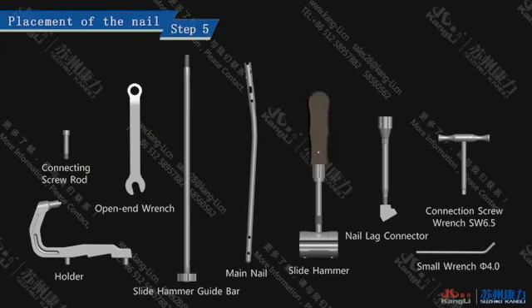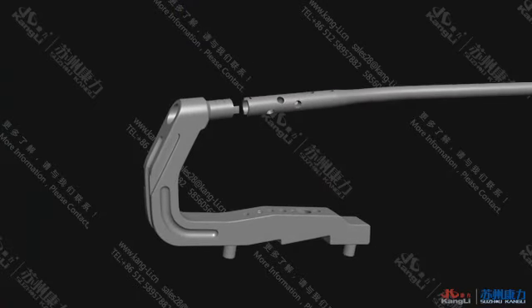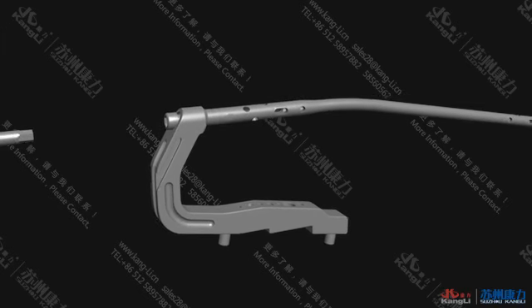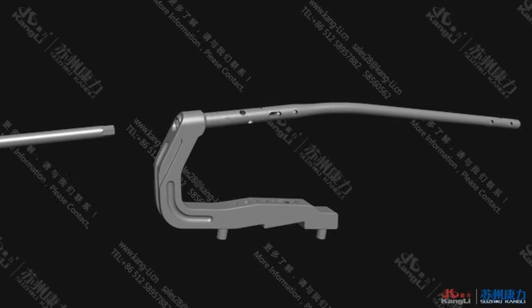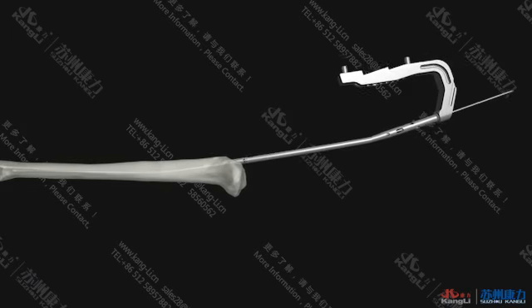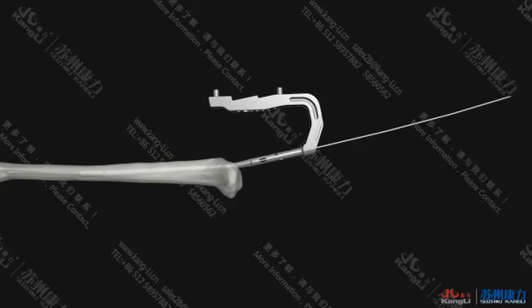Step 5. Placement of the nail. Fix the prepared nail of KTO tibial intramedullary nailing system onto the holder with the connecting screw rod and tighten it with the connection screw wrench. Insert the ball guide pin and rotate slightly for the entrance of the nail. After the entrance, keep the direction and directly insert it in.